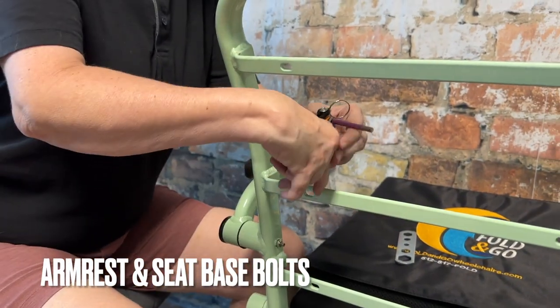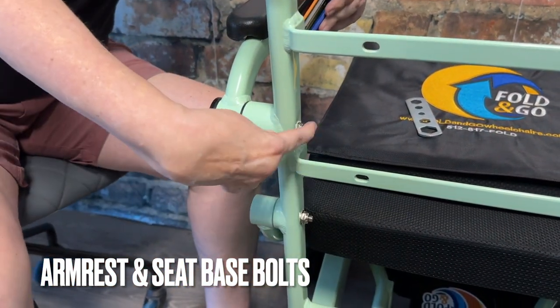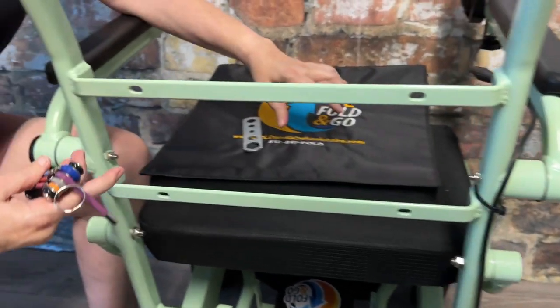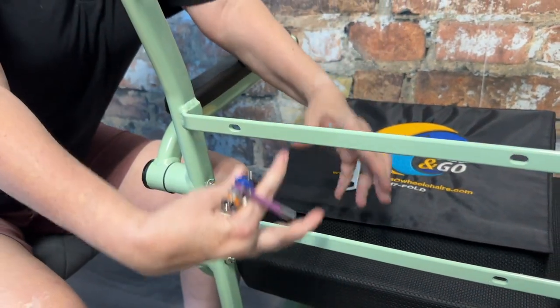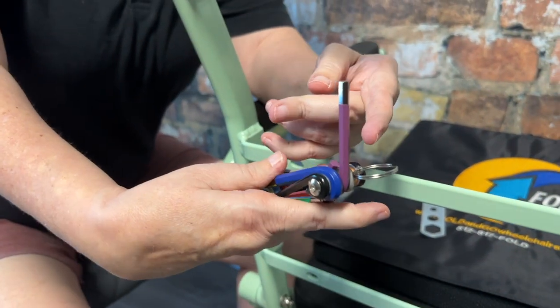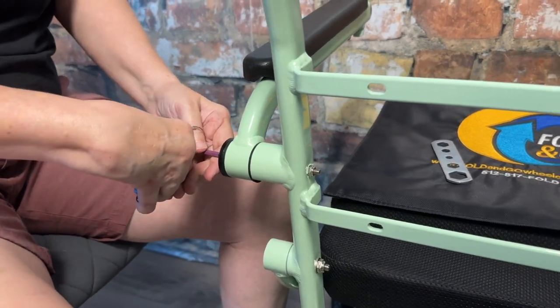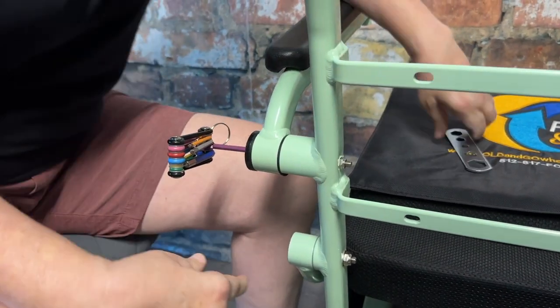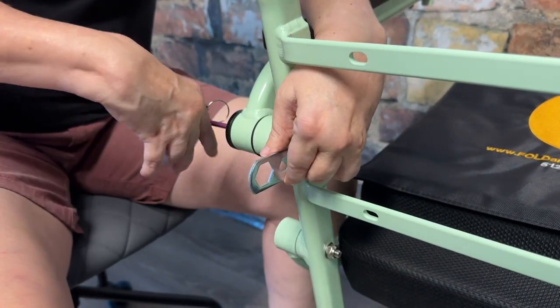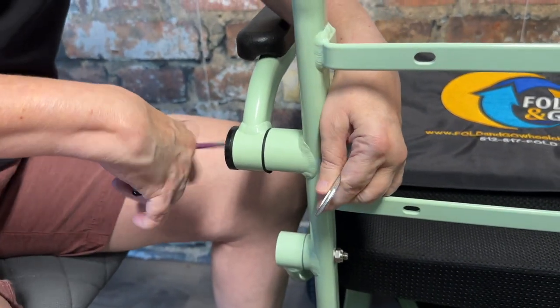Reposition the chair so it's back on all four tires. Now we're going to look at the armrest and seat base bolts — there's one bolt going through each armrest. We recommend removing the backrest cushion, which velcros on and off, just so you can see what you're doing. Use the purple allen: put one end in the bolt and use your makeshift wrench on the other. Righty tighty, lefty loosey — repeat for both sides.